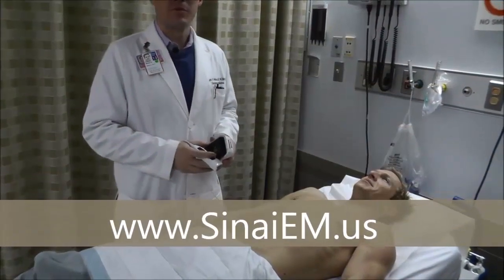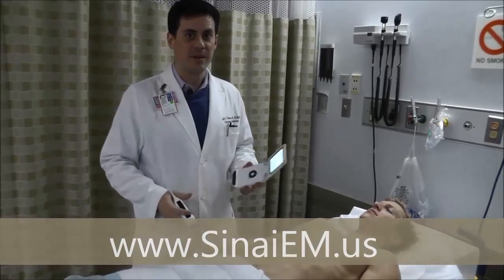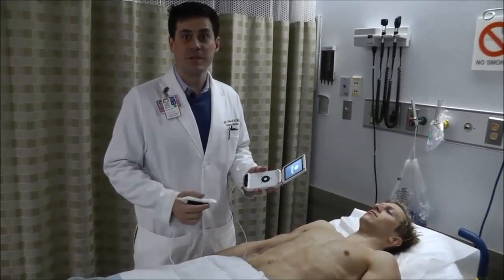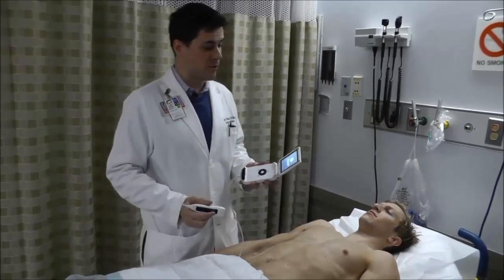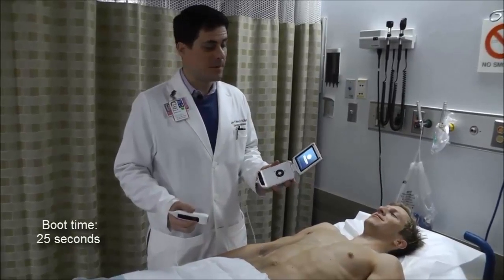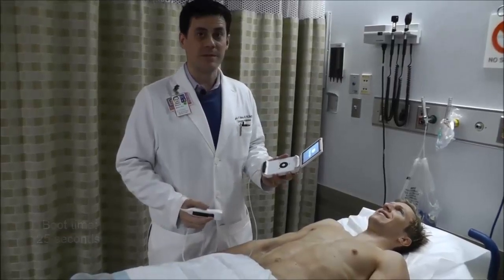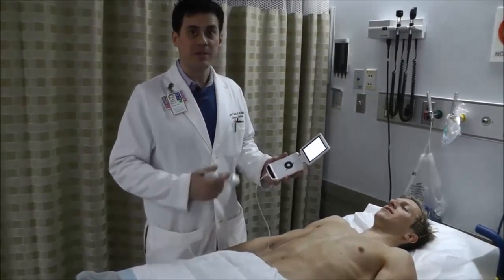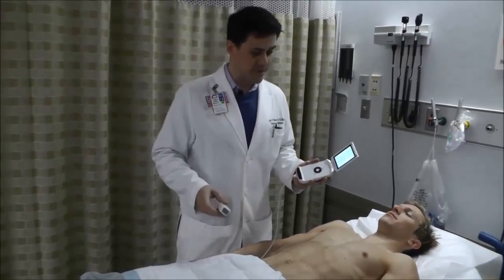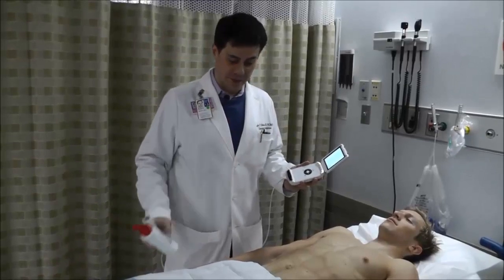My name is Brett Nelson from the Department of Emergency Medicine. We're going to go over how to use the vScan device to perform the ultrasound scans you'll need for your ASM1 curriculum. Opening up the device turns it on. Typically you're going to stand to the right of the patient when you begin your scan, and we're going to have some gel ready for applying to the patient as well.